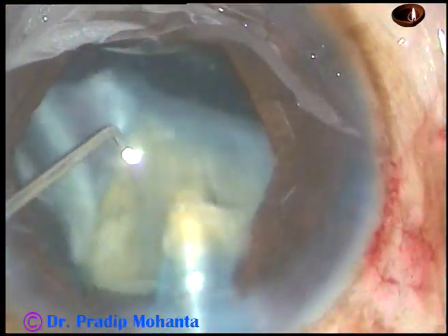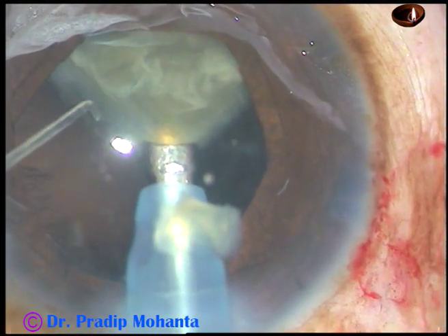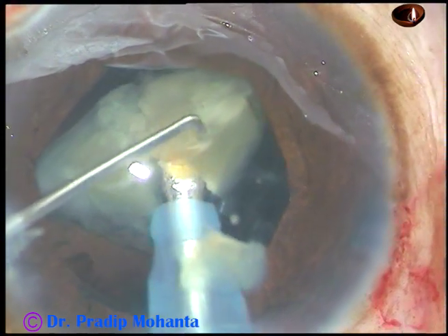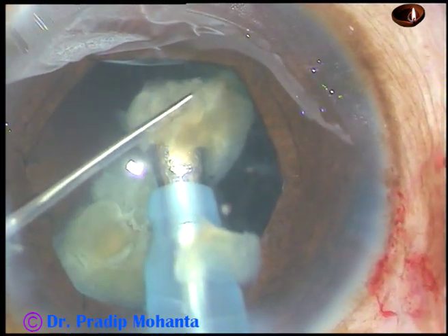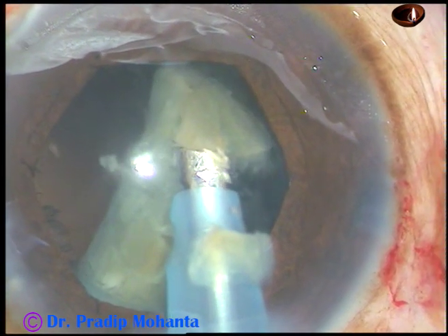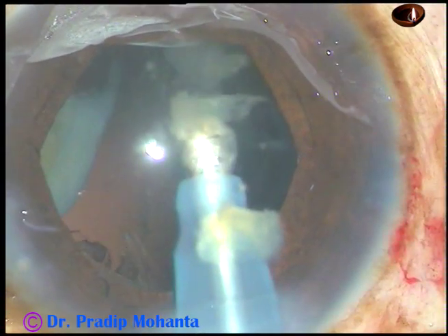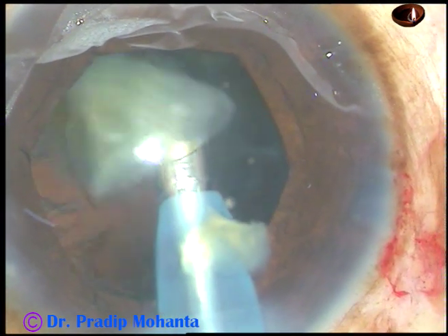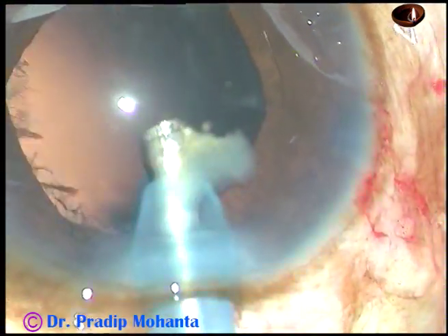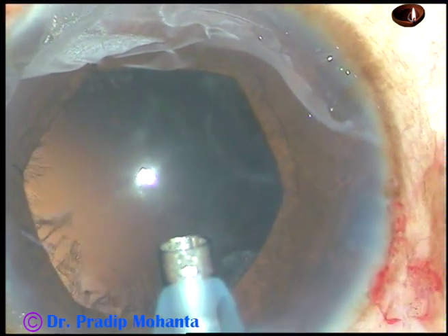This is the last nuclear fragment. At this time we can reduce the vacuum, we can be slow, and we can reduce the flow rate. Very carefully we do this. Removing the chopper so that the anterior chamber becomes more stable — the posterior capsule goes far behind. Now the other piece immediately comes to the tip. Hold the small nuclear bit and don't emulsify here; go to the center and then emulsify. This is the technique.